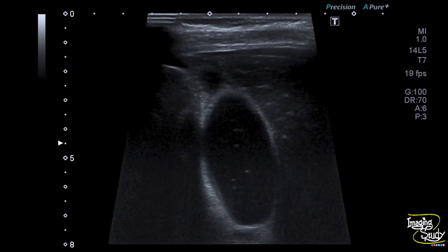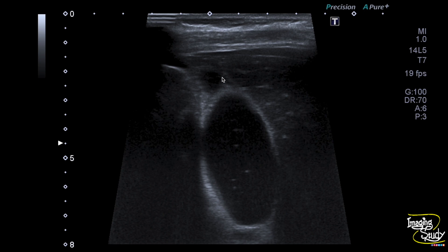Here's the magnified view using the high frequency linear transducer. You can see the gallbladder lumen shows tiny hyperechogenic foci. These are sub-millimeter in diameter. You can also see the collection adjacent to the gallbladder.